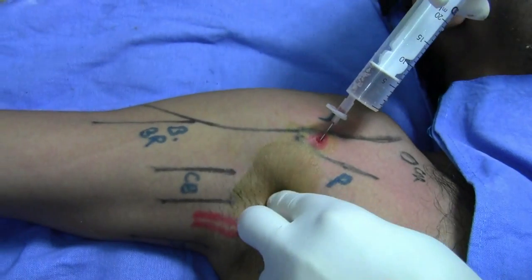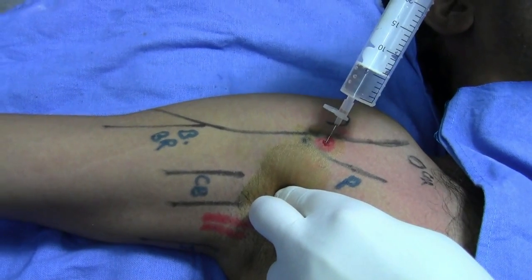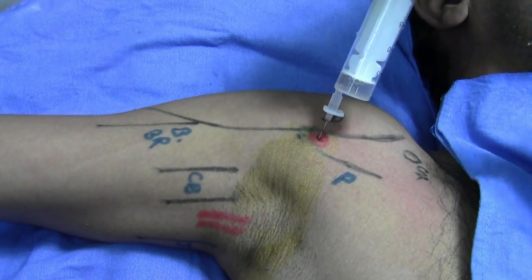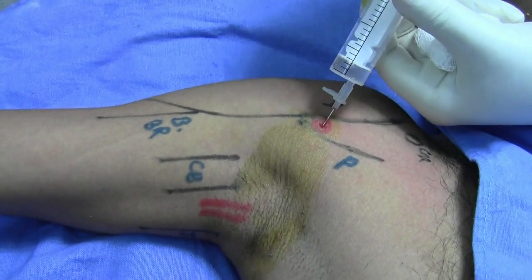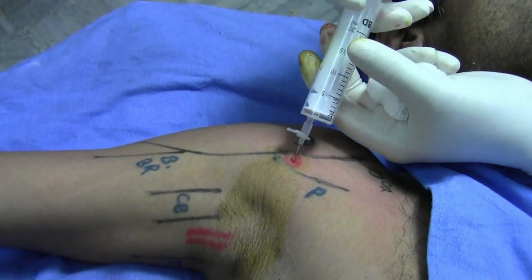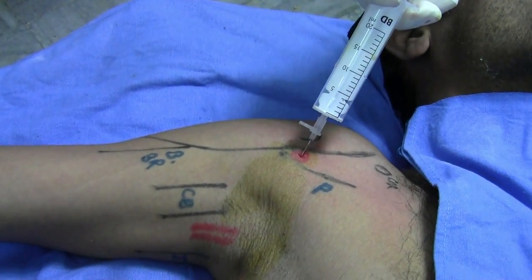Infiltrate in the superficial plane, making sure there is no blood, then infiltrate. This is a simple block, but make sure that if you puncture the vessel, any amount of local anesthetic entering the vascular system will be detrimental and of course very lethal.